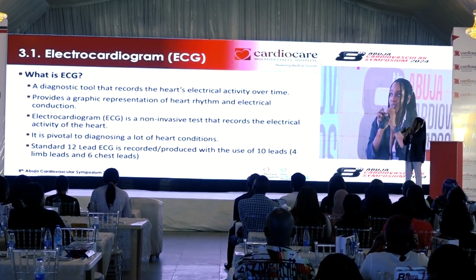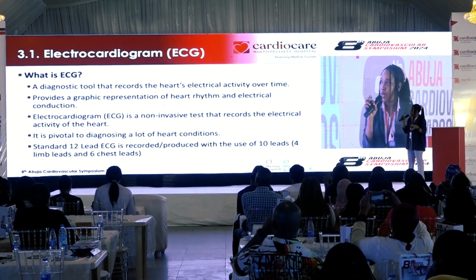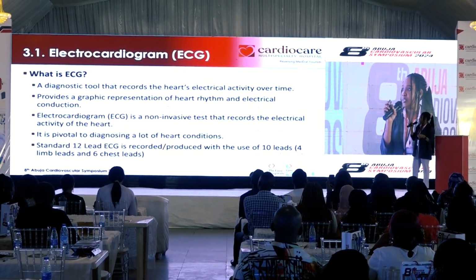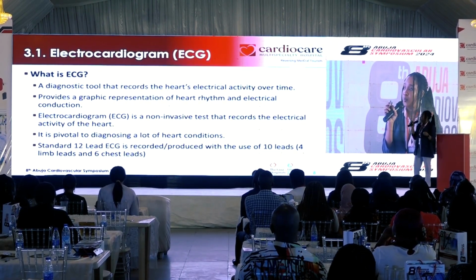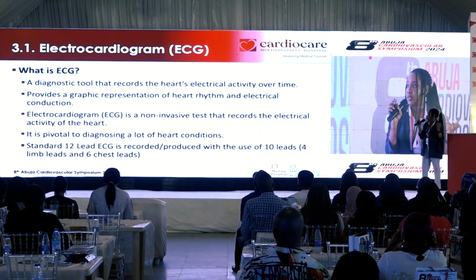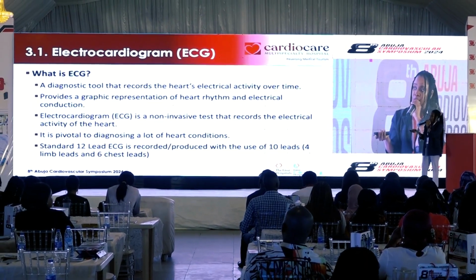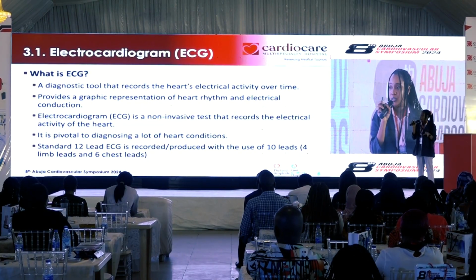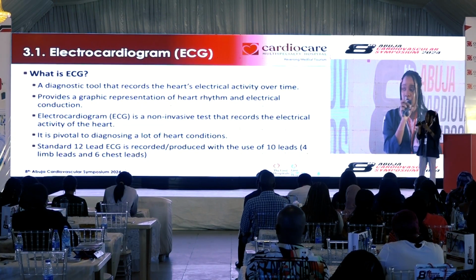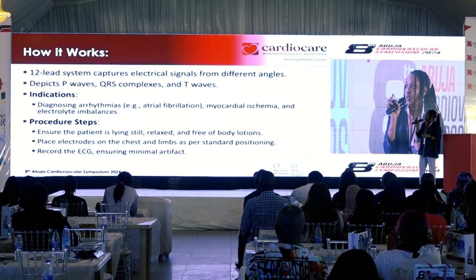So a quick one, what is ECG? ECG is a test we do to monitor the electrical activities of the heart, and it is a non-invasive test that helps in viewing the heart rhythms and also the electrical conduction. This is the 12 lead ECG, which consists of 10 leads, which is the 6 chest leads and the 4 limb leads.